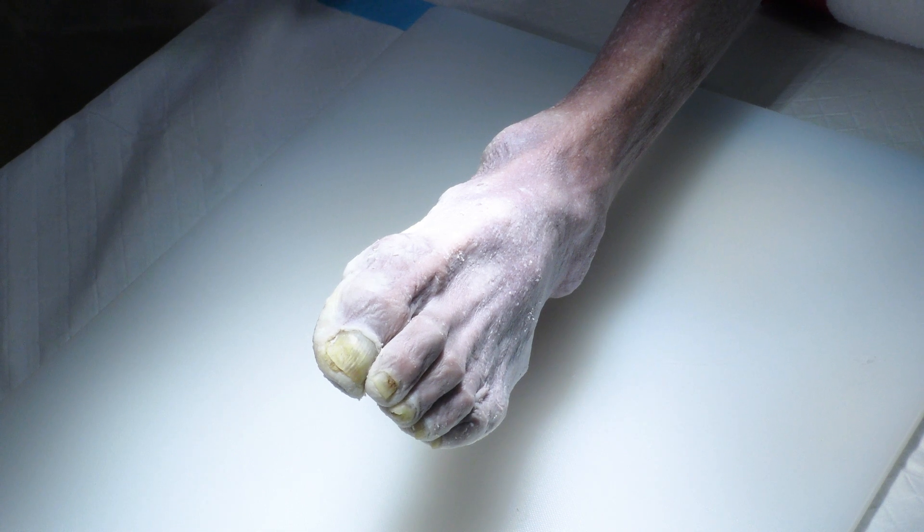My name is Dr. Martina Randall. I focus on foot and ankle surgery and today we're going to do a minimally invasive approach to a bunion using the Acutrex screws.